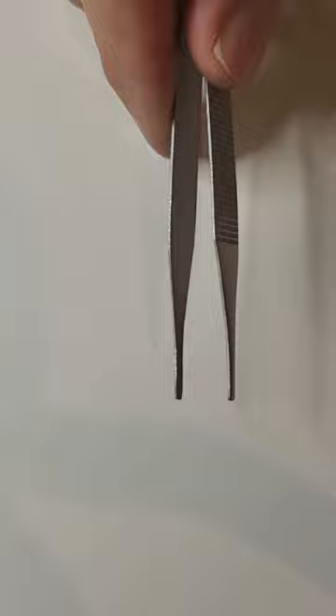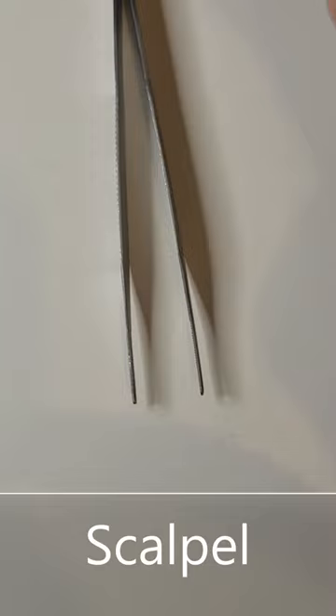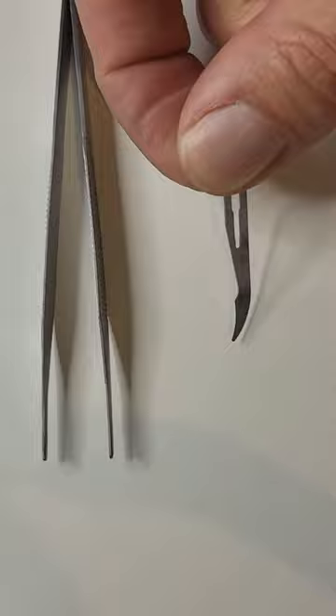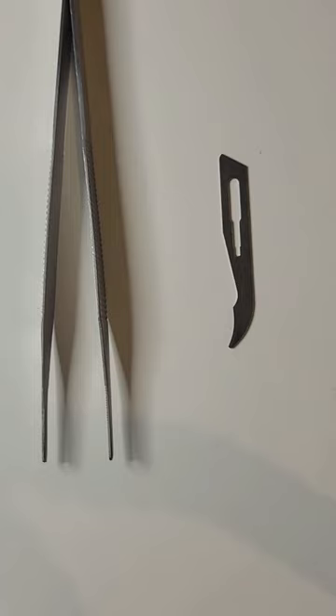You need two instruments to remove stitches. One is a disposable forceps — sometimes stitch remover kits also include plastic forceps. The second instrument is a scalpel. This hooked shape of scalpel is easiest for stitch removal; they are a bit hooked and easier to get under the stitches.